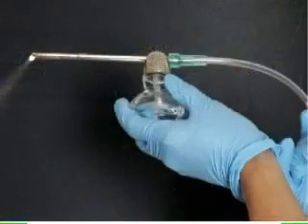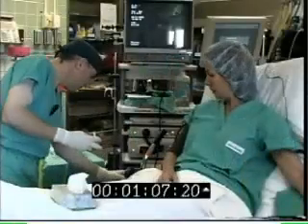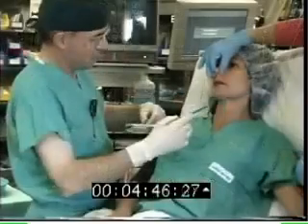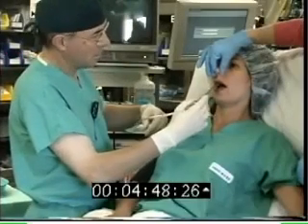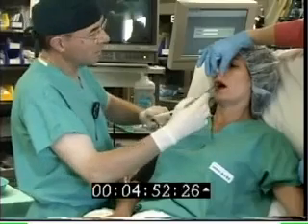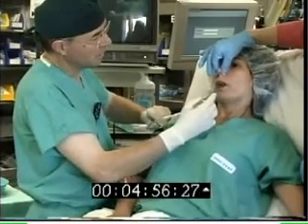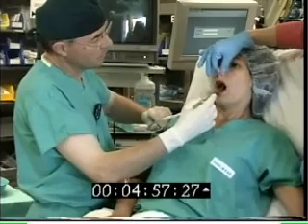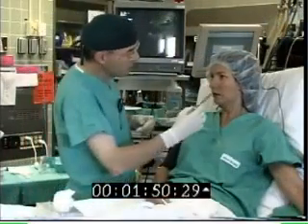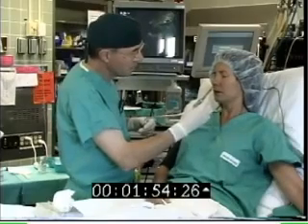This is followed by the use of a DeVilbis atomizer attached to oxygen tubing with 8 liters per minute of oxygen flow. The DeVilbis atomizer is filled with 12 milliliters of 3% lidocaine using 4% lidocaine solution diluted with water. The patient's cooperation with respiratory effort is essential while using the DeVilbis atomizer. If nasal tracheal intubation is anticipated, the application of the local anesthetic should begin with the selected nostril.